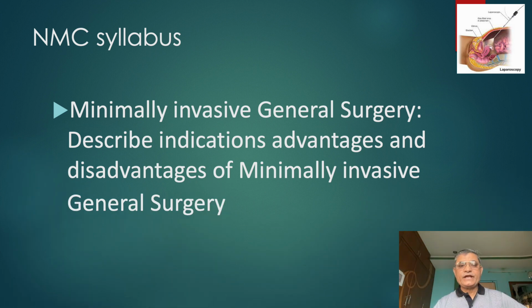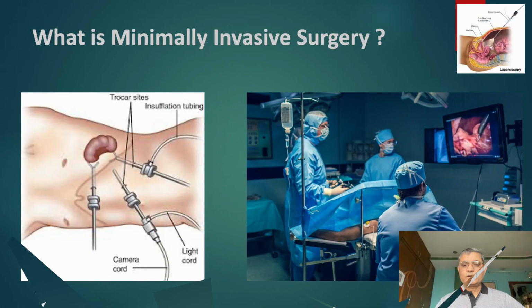The National Medical Council gives the following syllabus to be followed for the MBBS students. Describe indications, advantages and disadvantages of minimally invasive general surgery. Shall we see how a laparoscopic surgery is performed?